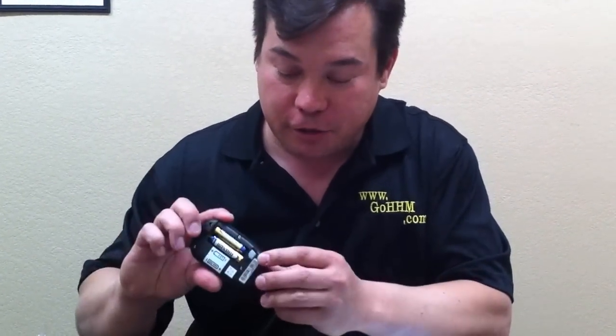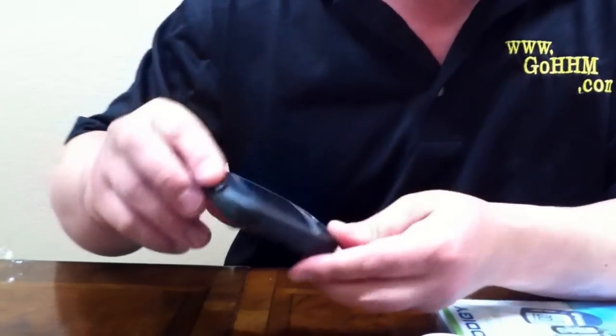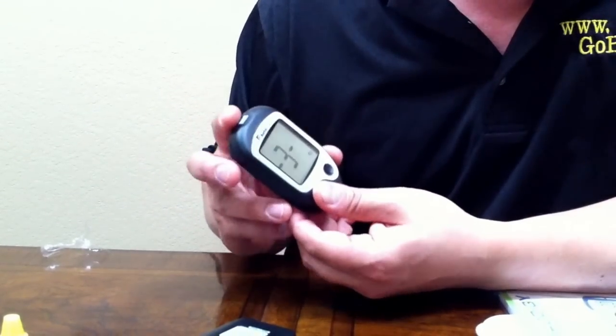You can change the speech on this and the language from English to Spanish to French to Arabic. For the sake of this demonstration, we're going to leave it on English. Once you have set your language, you push the S button on the back next to the battery compartment for the volume — volume of 3, 2, 1, or off.